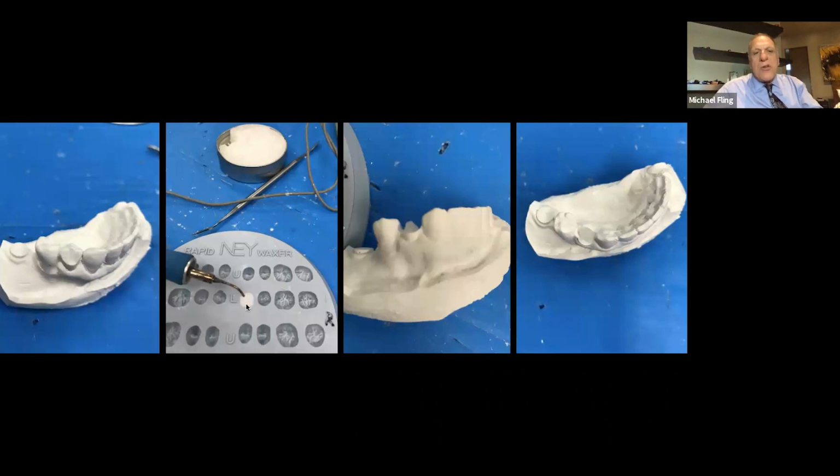If you're going to fill these up with wax, don't get your pen and put it in the wax and carry it over and fill it that way. It'll take all day and you'll want to shoot yourself. It's not worth it. Get the waxer that I talked about, turn it up to the highest temperature it will go. Get your stick wax, hold it against this shank right there, and it will drip into there as fast as it can. And then you let it harden, you pull them out.